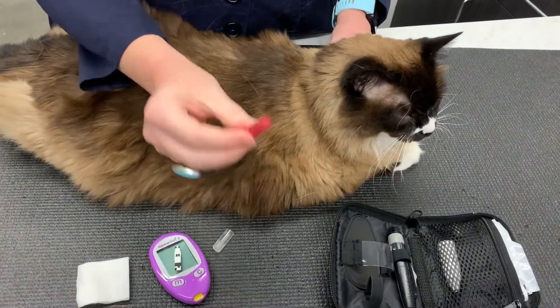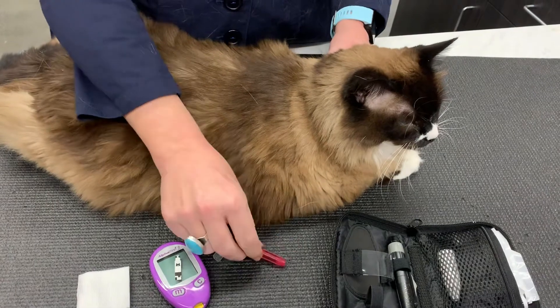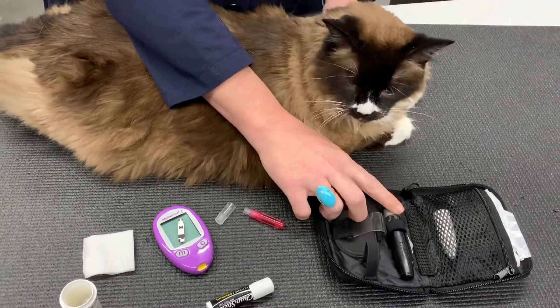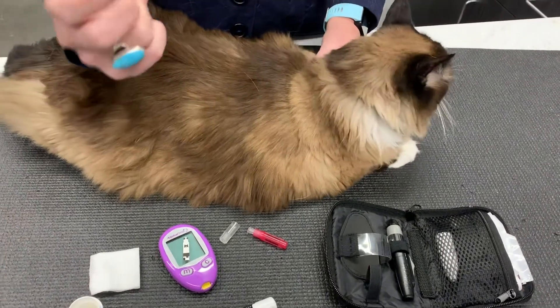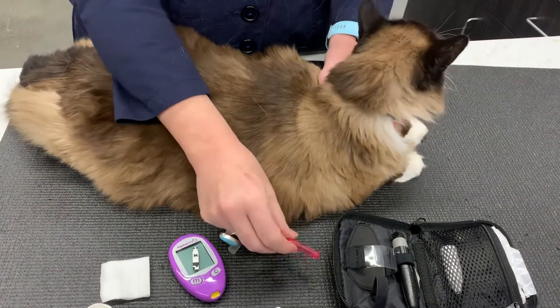I use a 25-gauge needle — a new one, not a used one — rather than the stylet, because the stylet makes a snap sound that scares the cat. This is silent, so I like that.